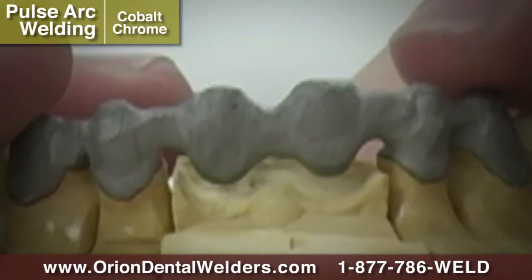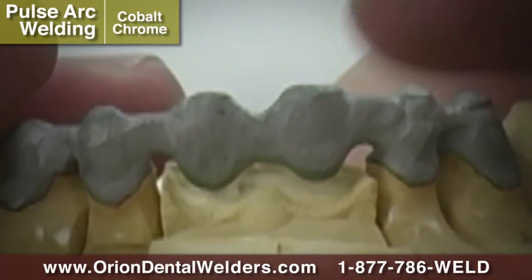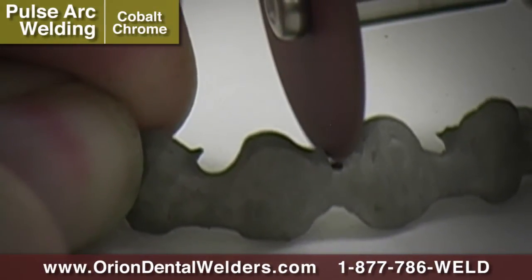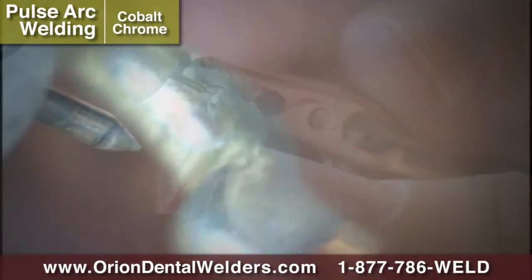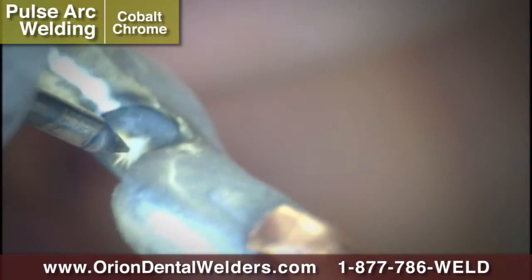The Orion Dental Welder can help you repair a warped bridge in one weld. Cut approximately one quarter of the way through the bridge on the side to compensate for the warp. Use the Orion in Pulse Arc Mode to produce a large weld and to warp the bridge into place.